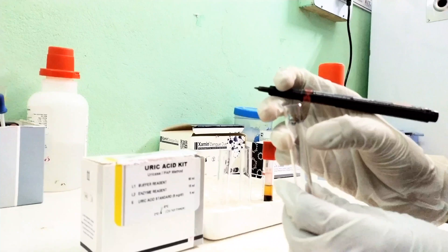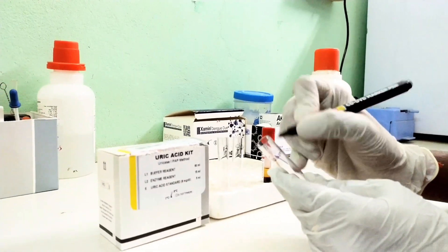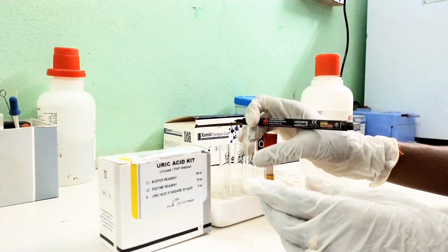Firstly, I take three test tubes on a rack and mark them with a marker pen: blank, standard, and sample or test.